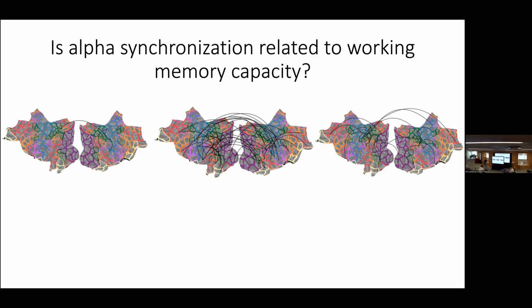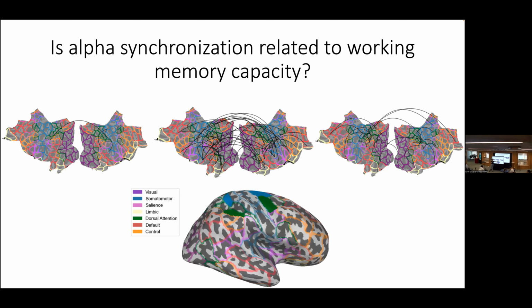I tried not to do any sort of group analysis, but I was a bit curious to see where the overlaps were. The overlaps between these subjects are here in the parietal areas and around the frontal eye field. And those are the areas that you would get if you were doing an fMRI study on working memory and seeing where the activity is. You get especially parietal and frontal eye field activations. So that was a good check to see.